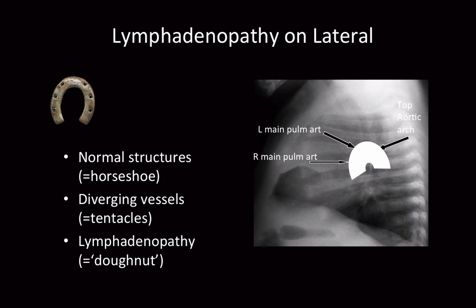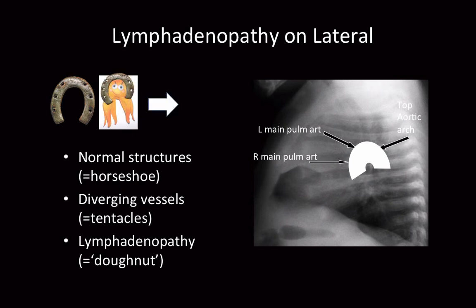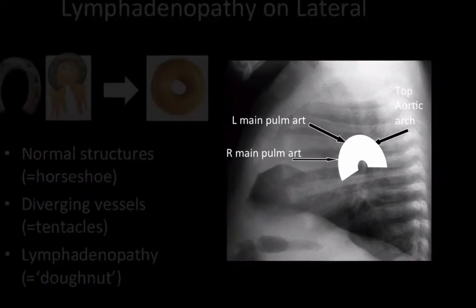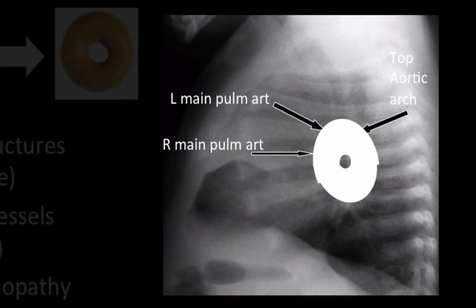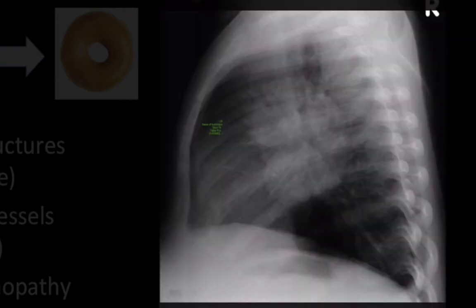For those of you who don't know what a horseshoe is — it's a metallic structure used on a horse's hoof. I've put in an octopus because the vessels extending below the horseshoe look like tentacles — they basically diverge in all directions including in and out of the page. The lymphadenopathy you will see on a lateral x-ray simplistically looks like a donut. That's what the donut sign looks like on a lateral chest radiograph.